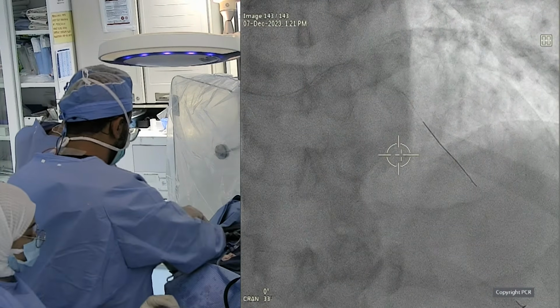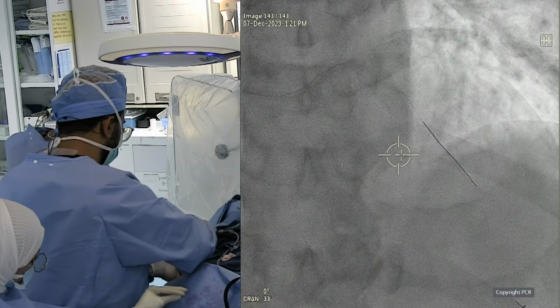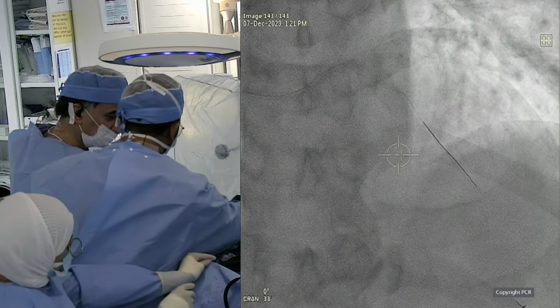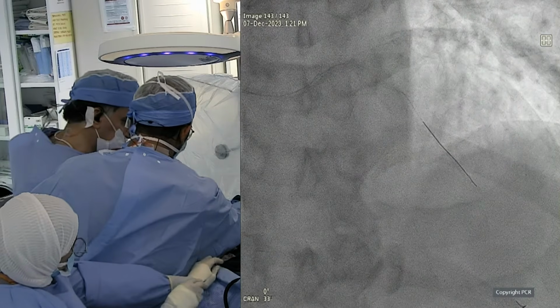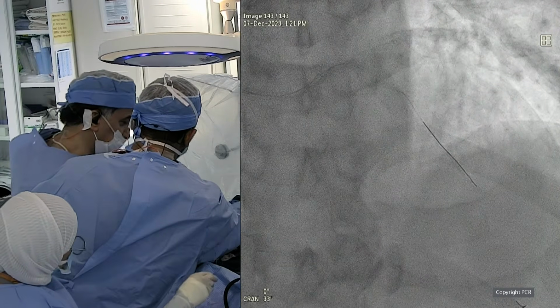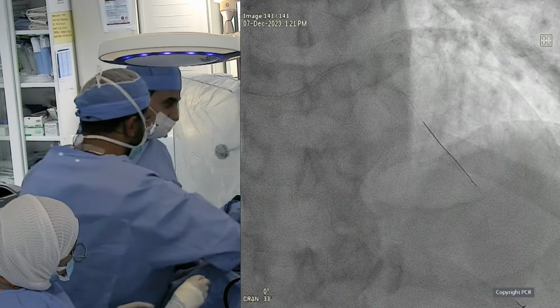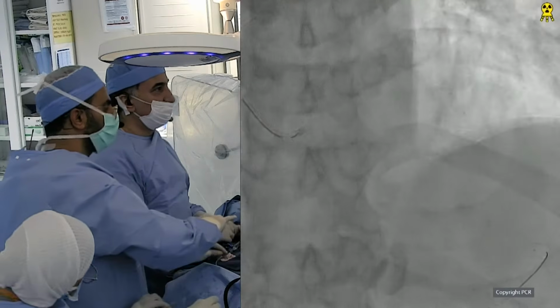The other thing that I would do when I have a heavily calcified bifurcation vessel like this one, I've been shying away from a 6 French guiding system. If I have radials, I go straight with 7 French, with the big guns, to have maximum backup.